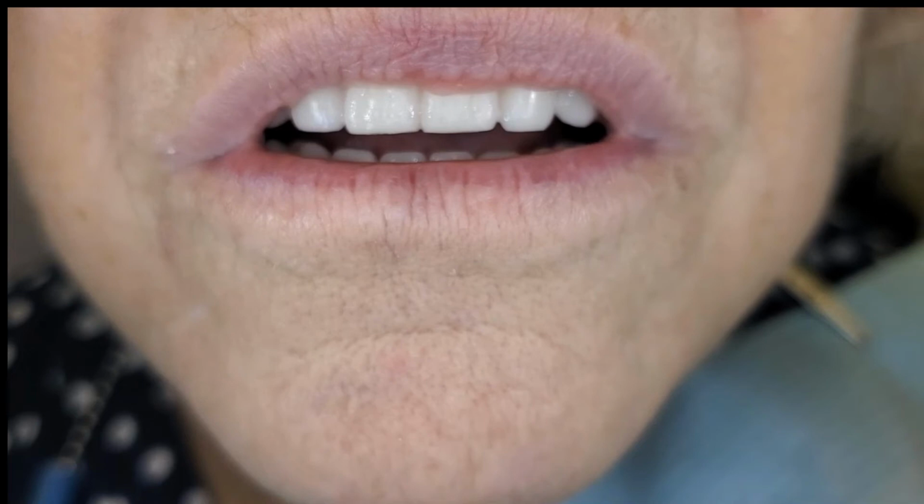That posture didn't go away. So now that doesn't go away. I had to set the teeth for that to function within this woman because that's how this works for her. This is her. So now I cleared all the teeth. So you can see like when she speaks, everything has that clearance out to her left.